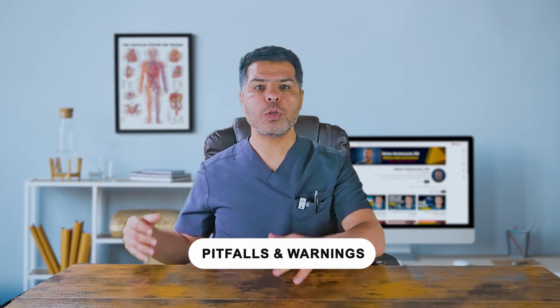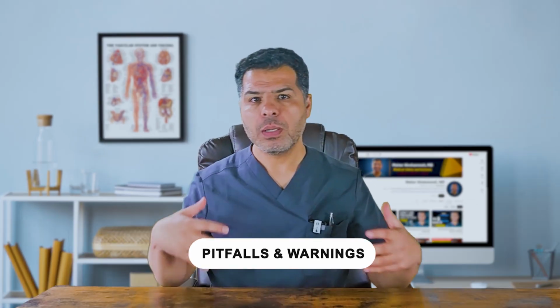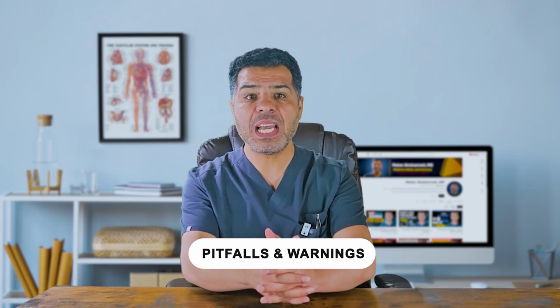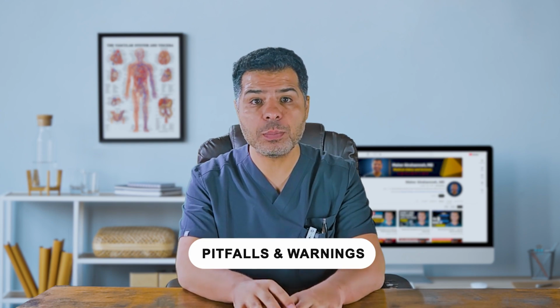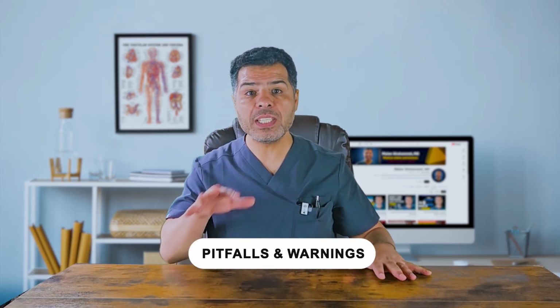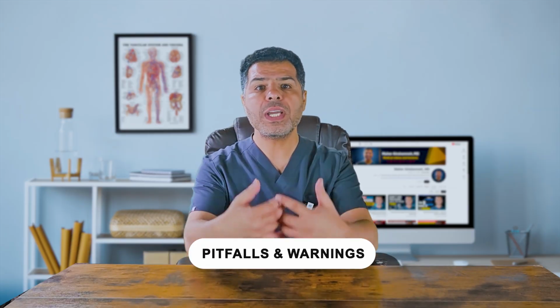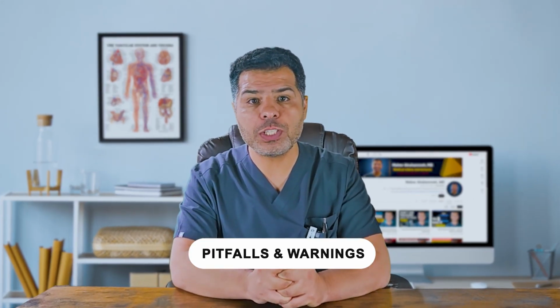Chronic Foley use causes complications over time: bladder stones, chronic UTIs, urethral erosions, and increased bladder cancer risk. Yes, it does increase bladder cancer risk. For patients who need long-term catheterization, consider alternatives like suprapubic catheters or intermittent straight catheterization if appropriate.